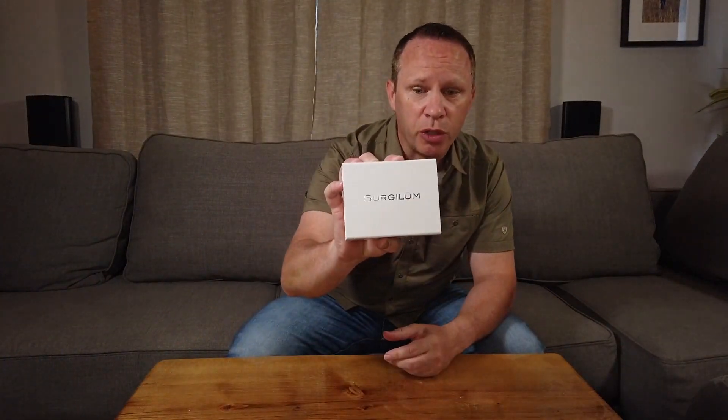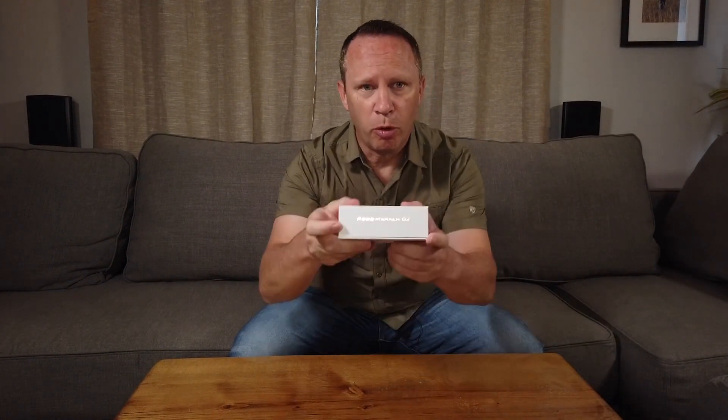Let's get this opened. I've got the box with the Surgilum Robomarker G2. Let's open this up and see what's in here.